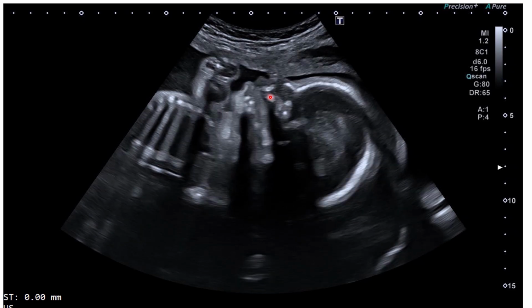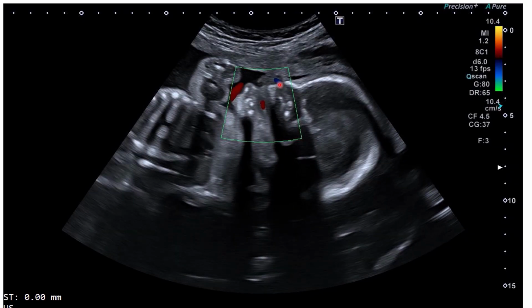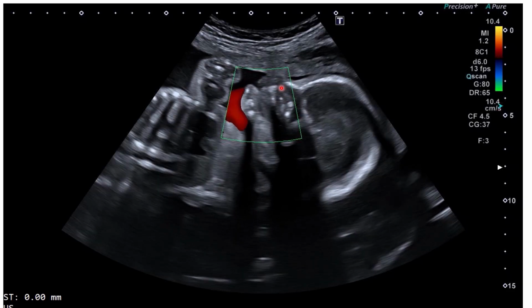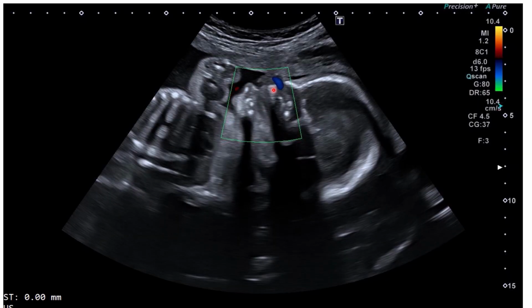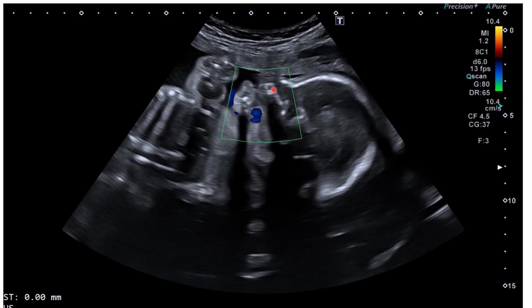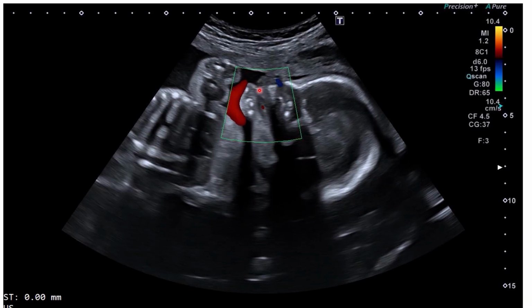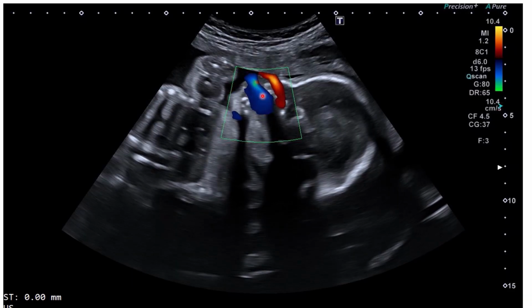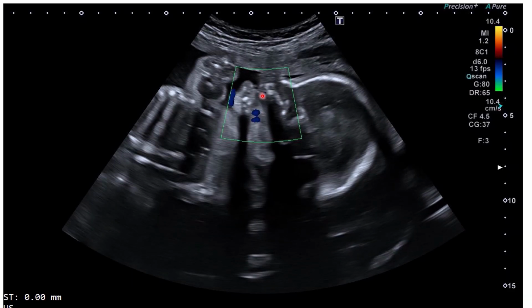Have you ever observed that, or you guys are just busy every day? Look, red, red there. Look, blue, red, blue, red, blue. So the different types of motion, breathing in, breathing out. Look at the mouth again. You can see in and out. Breathing in and out.